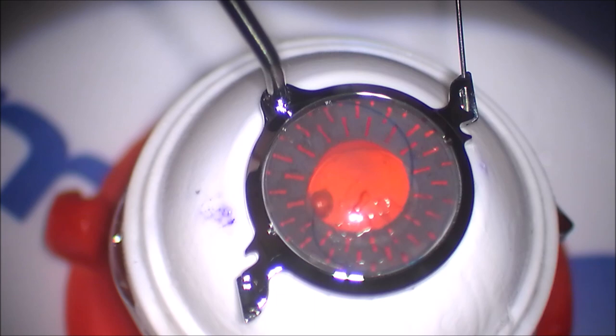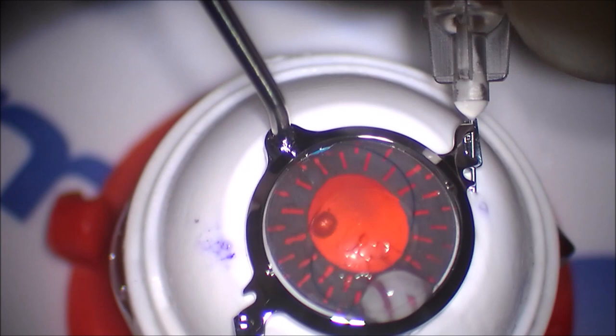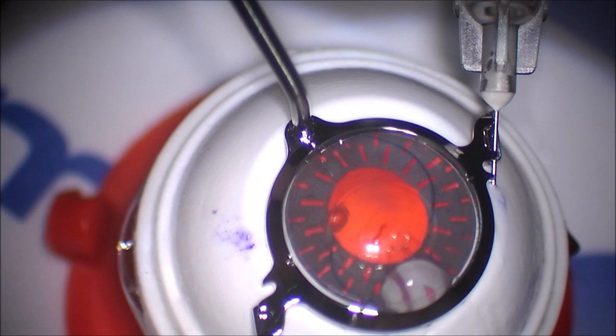But you know, it's a little bit tricky. In order to maintain the needle against that tracking guide, it's not that easy. Again, this is my first time using it, probably gets better as I use it more.